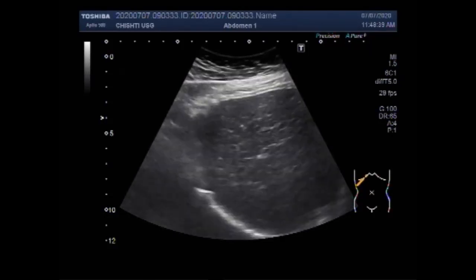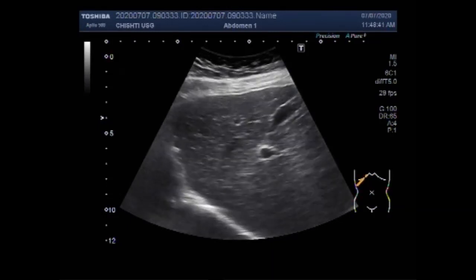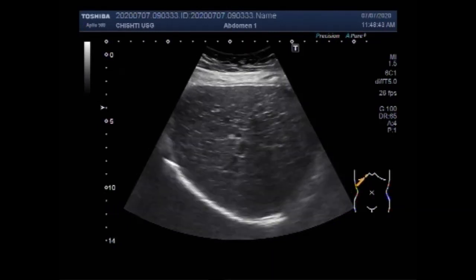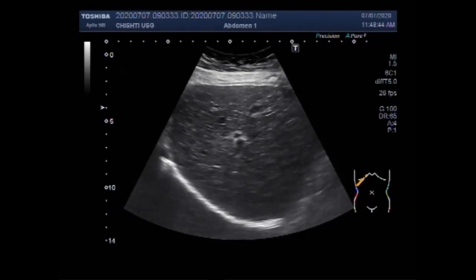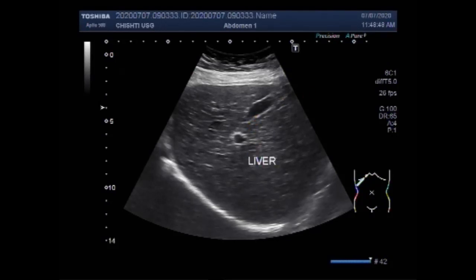You can see the liver and the gallbladder. The hepatic parenchyma shows coarse echotexture. This is the liver and gallbladder.